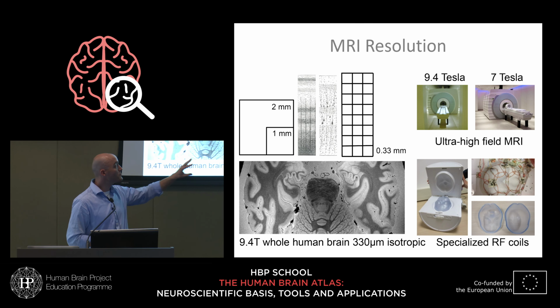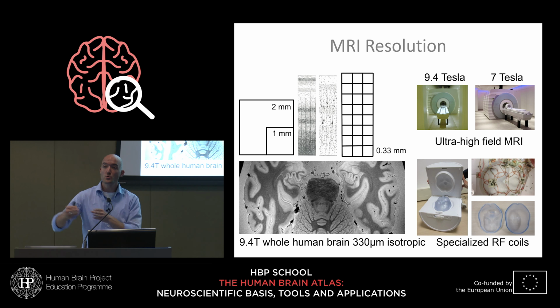But when you build this coil really to a level where it can get very high SNR, you're also pushing your preamps much harder. They will break. They have to be fixed every 2 months or so. The coil has to be perfectly tuned. So you need manpower. You need serious manpower just to keep RF coils running.